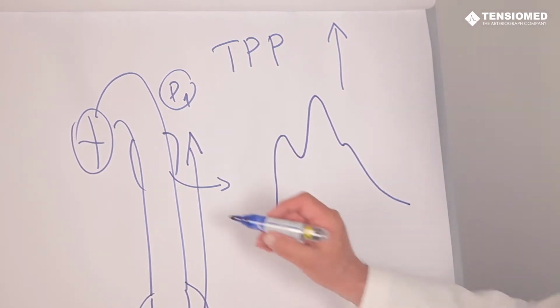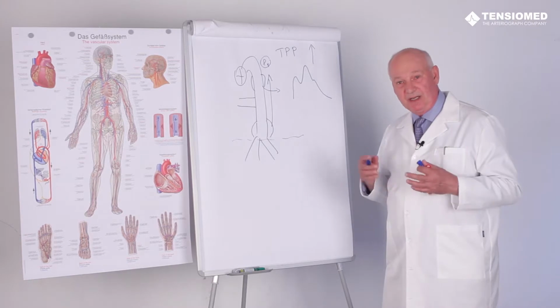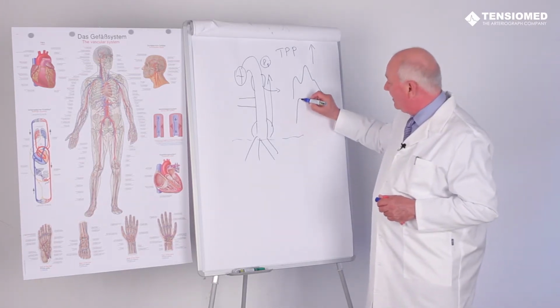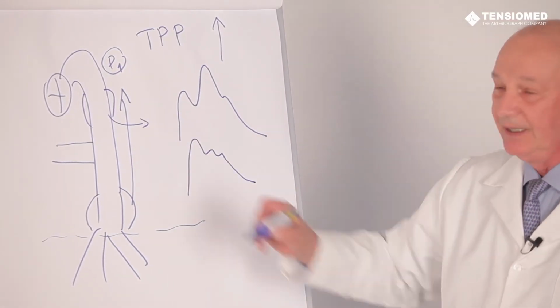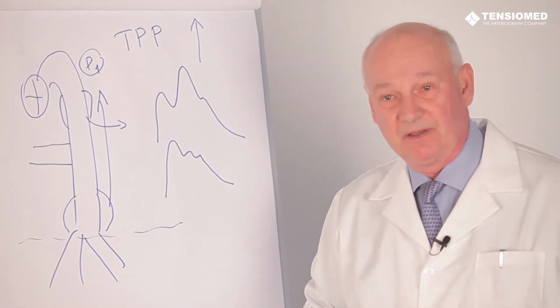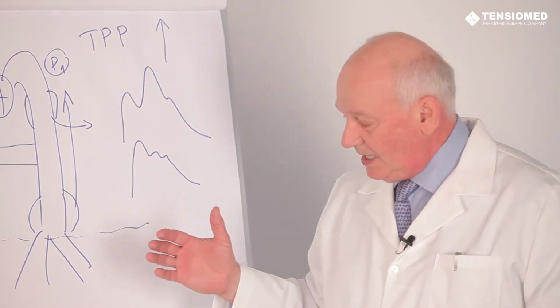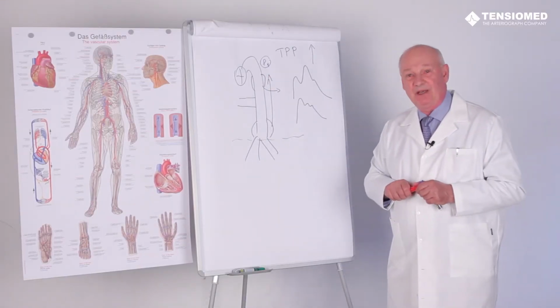On the contrary, when the vessels are dilated, mostly the small arteries and arterioles, the reflected wave amplitude will be much smaller, due to the dilated peripheral vascular resistance and dilated arterioles. This kind of augmentation index change can happen very quickly.